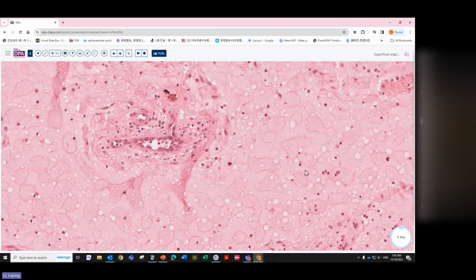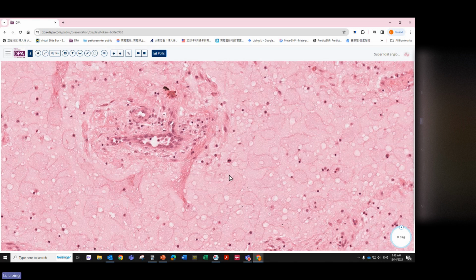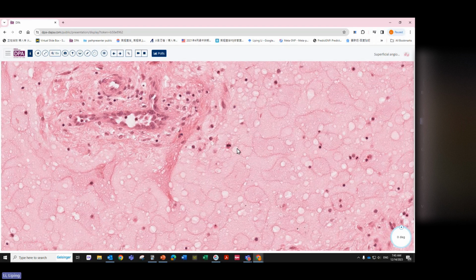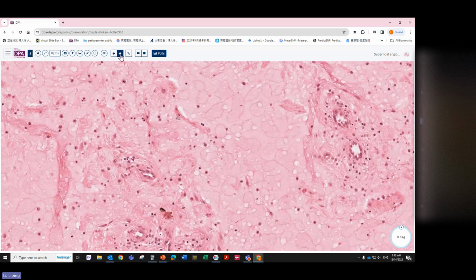And then again, we see our neutrophil again. So if you forget all of the stuff about this entity, remember this neutrophil, especially if you are not thinking about it. When you zoom in on this hypocellular entity, you find neutrophil. Oh, you're thinking maybe this is cutaneous myxoma.